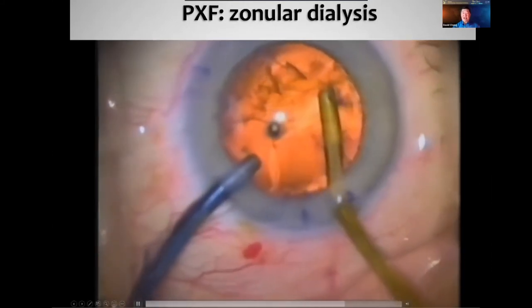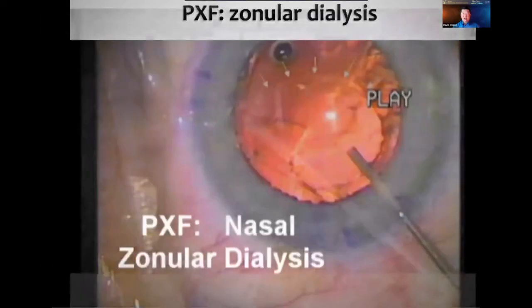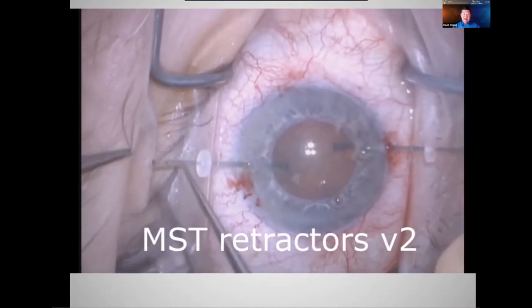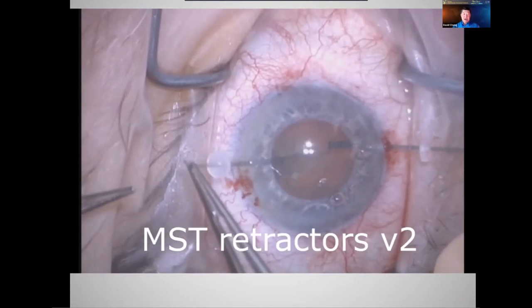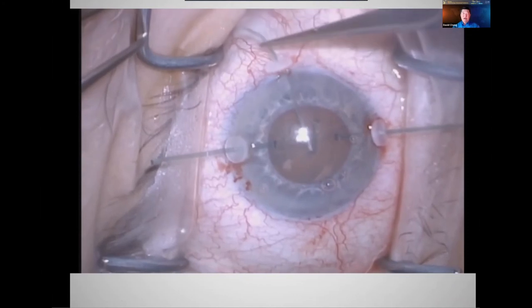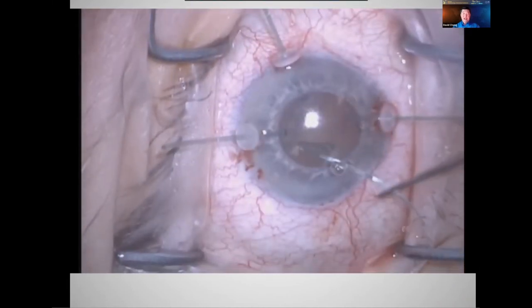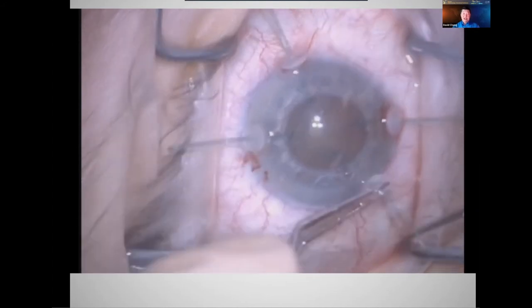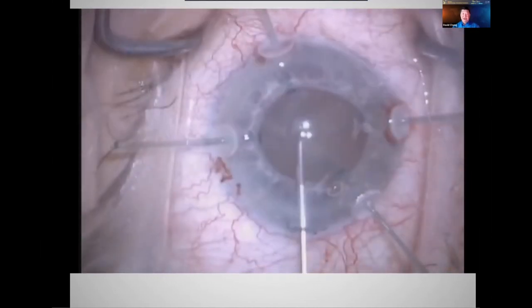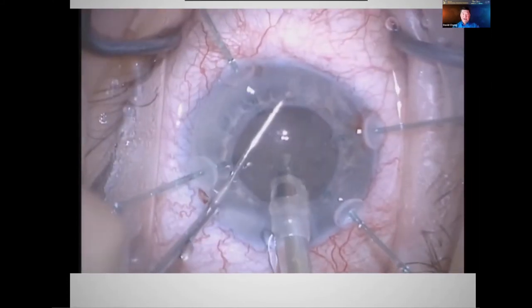I've got tremendous loss of zonules all over — I don't think I caused all of that. This is a case with severe circumferential zonulopathy. I can't get the cortex out, and when I pull on it the entire capsular bag moves because those forces are transmitted by the CTR to all 12 clock hours of the zonules. I've created a mess by putting in a CTR when I didn't really have good zonular support. What I really need is capsule retractors — these are from Microsurgical Technologies. This is my modification: it's a little shorter with a closed loop, but inserted like iris retractors.